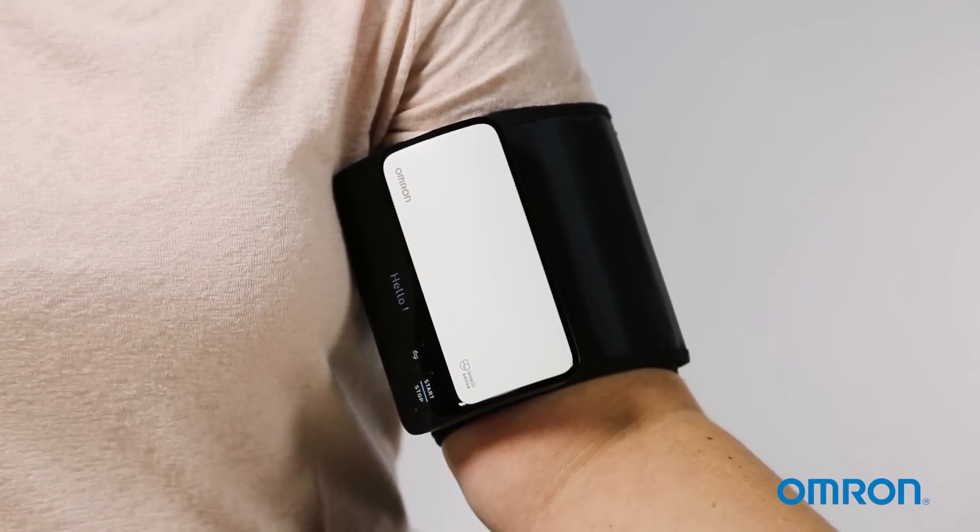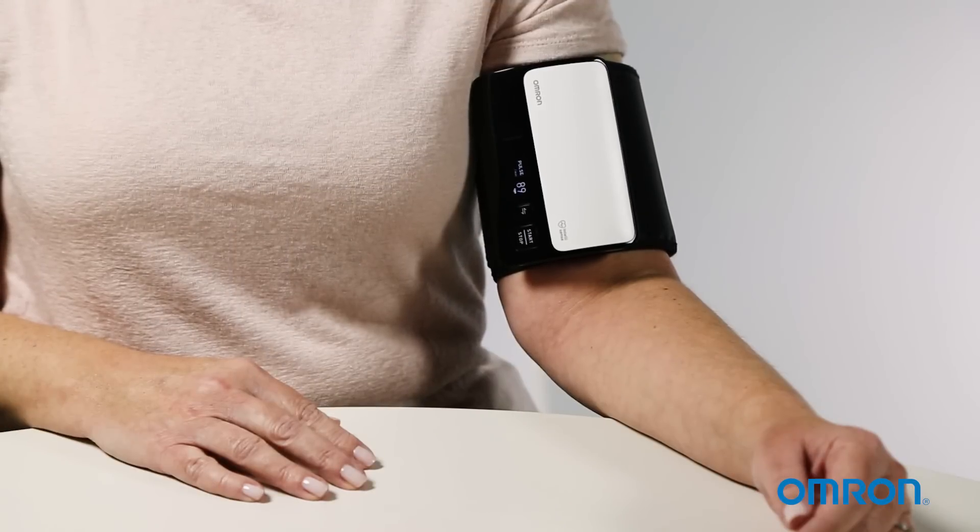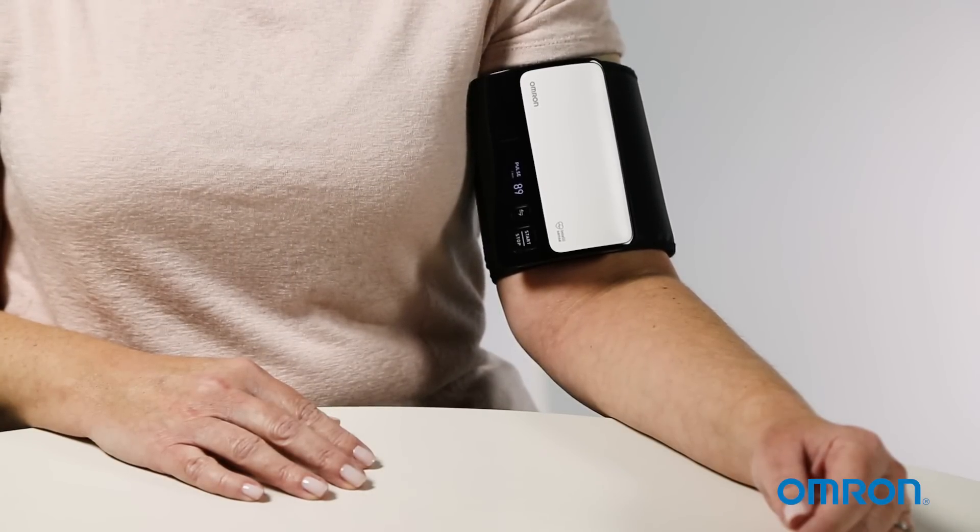Press the start/stop button to start taking your measurement. Remain still until the cuff automatically deflates and your readings appear on the monitor screen.